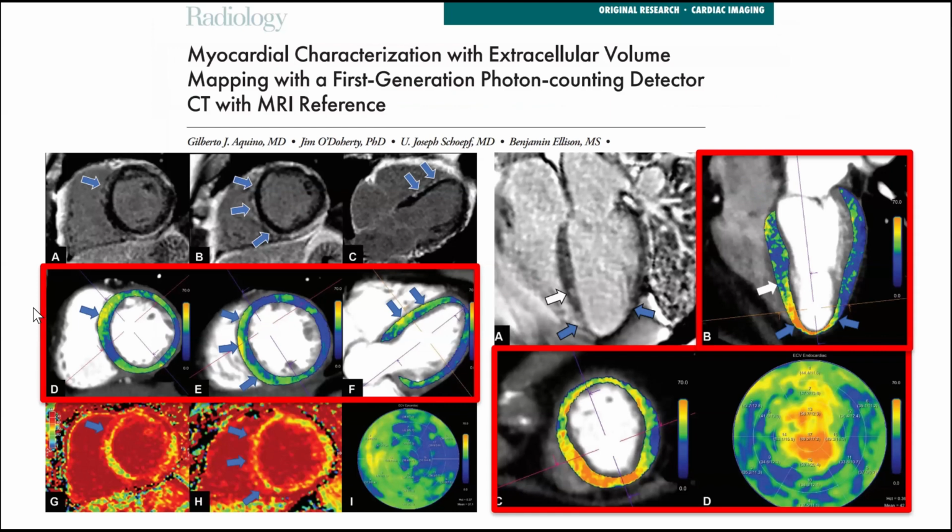a lot the image quality that we have seen until now in this presentation, both in the LGE, but in particular in the ECV, a very high quality assessment of the ECV, or the low contrast resolution that allows to have a panoramic assessment, and that essentially provides us all the information that we need, combining the information of the normal enhancement.